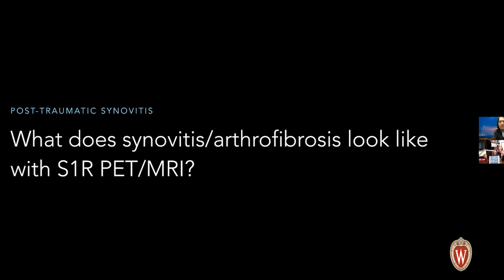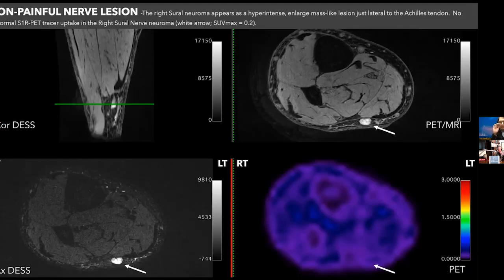Sandip, can we go back to that for 1 second? Sure. Now, in general terms, anytime we would see a neuroma like that, you would just automatically jump to, all right, we need to take that out, translocate the nerve into some muscle with whatever graft or however we want to do it that day. And this case would fail. And we may actually make the patient worse in this case because we played with something that wasn't a pain generator and maybe could make it a pain generator.